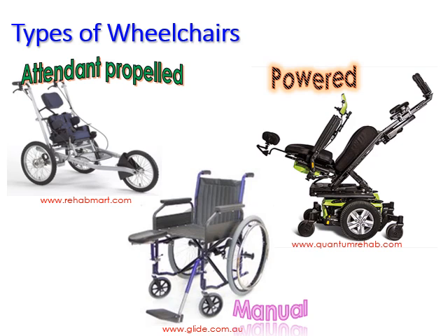Then the middle picture shows you a manual chair. That's the standard wheelchair that we're used to seeing. A standard chair has two back wheels, two front wheels, and room for both limbs. In the picture, you're seeing an amputee frame, a specialized manual chair for somebody who's had one lower limb amputated. There's also something called a hemi chair, for somebody who's had a stroke and is going to propel the chair with one leg and one hand on the same side.